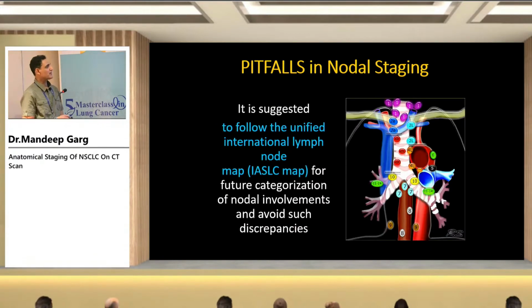So to overcome this discrepancy, I think all of you must be aware of this lymph node station, which is a unified international lymph node map given by IASLC, so that there is no ambiguity when we classify the lymph nodes using this international lymph node map.